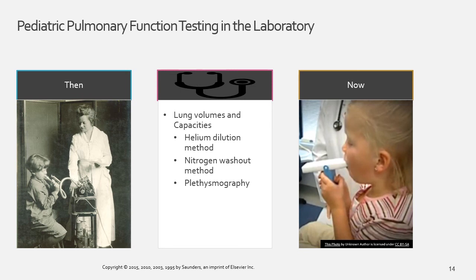pneumotachometer is used to calculate a volume measurement, the TGV. The TGV is measured at a known FRC value rather than on the basis of assumed values. Total lung capacity is obtained by adding the inspiratory capacity, measured by spirometry, to the FRC. To calculate the RV, the expiratory reserve volume is subtracted from the FRC. In addition to measuring lung volumes, body plethysmography measures resistance and specific conductance.